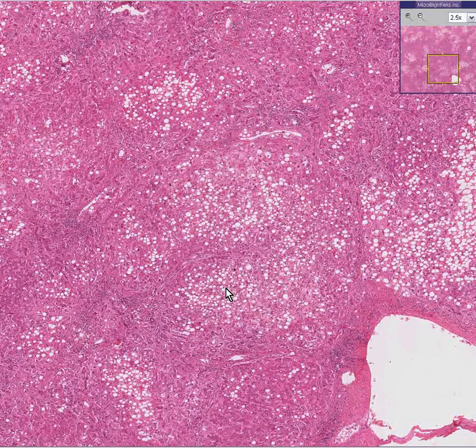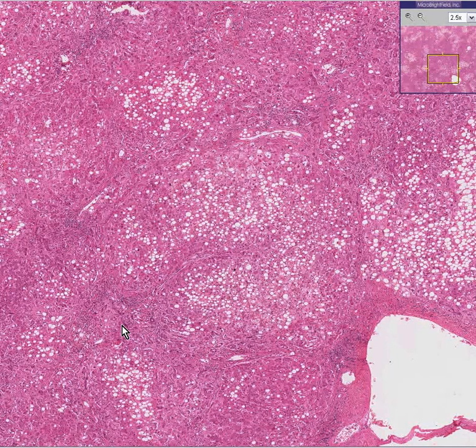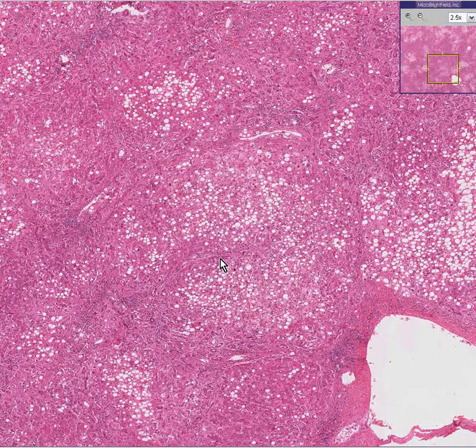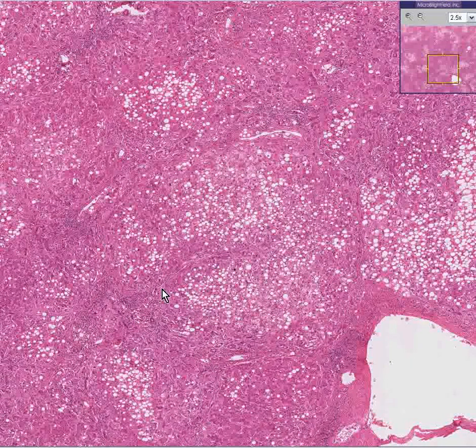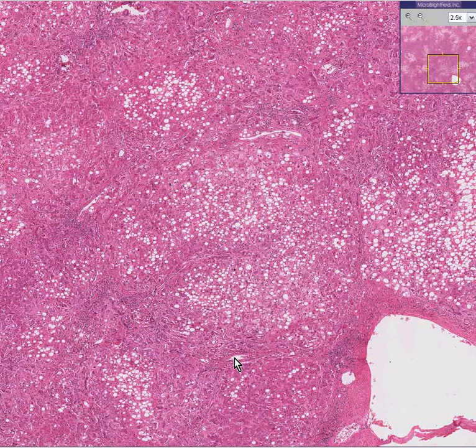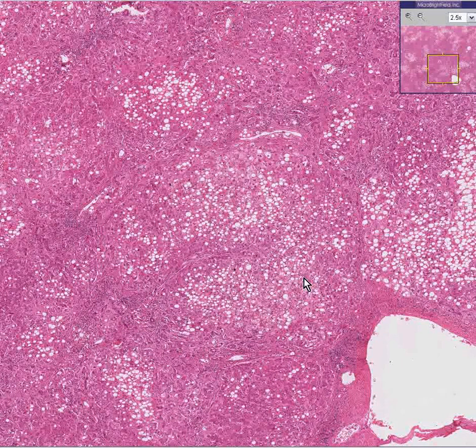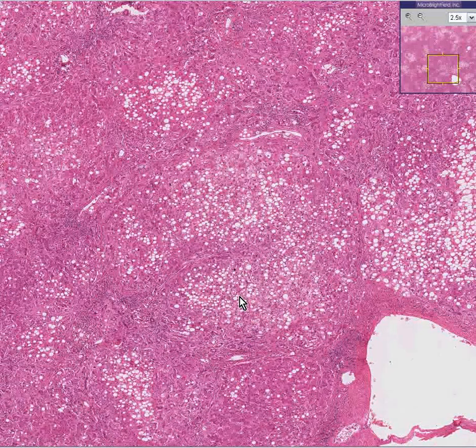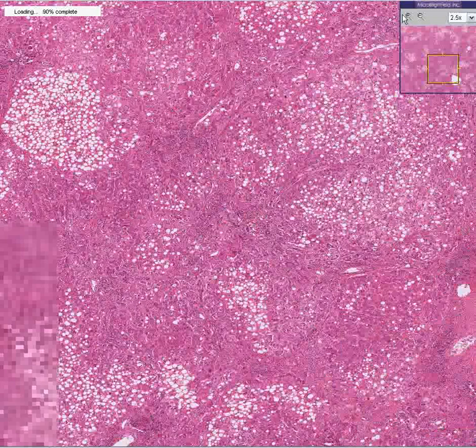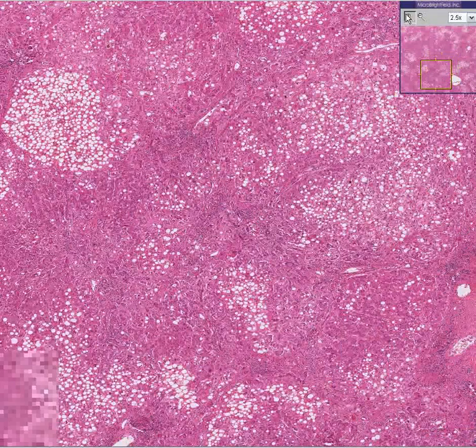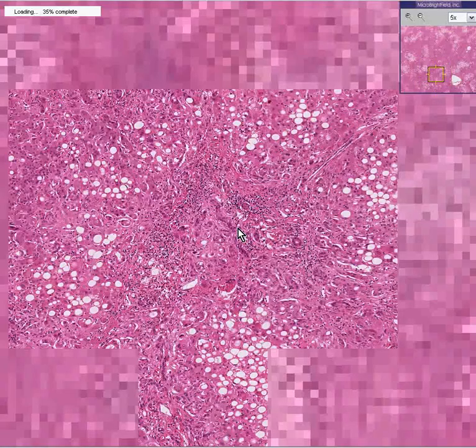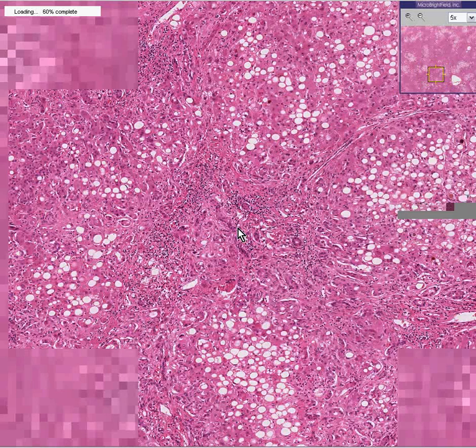Another thing you could notice about this liver, besides being early cirrhosis with these thin little bands bridging from portal area to portal area and creating nodules filled with hepatocytes being replaced by fat, is that it's also inflamed. So for a good reason, this is also termed alcoholic hepatitis.